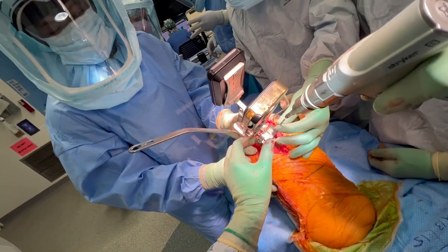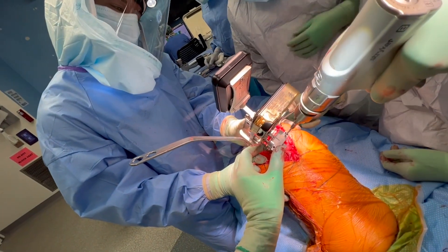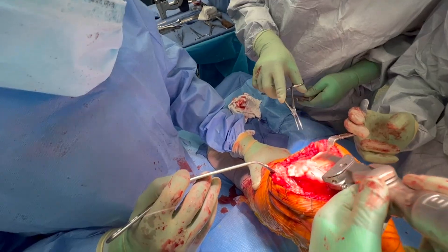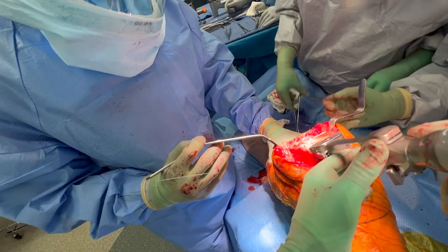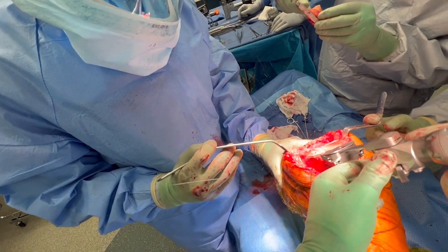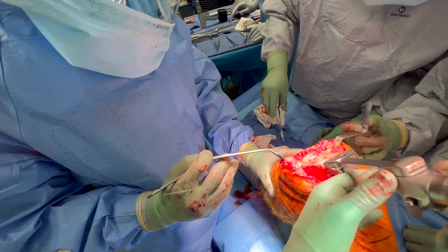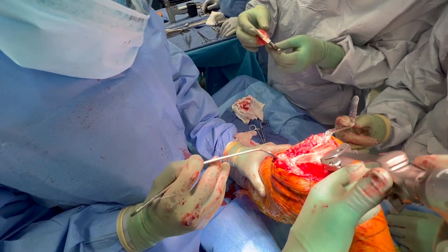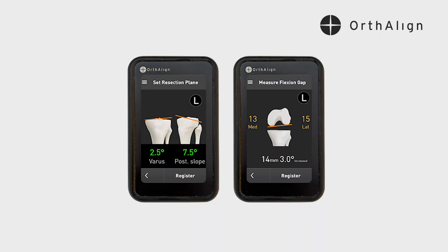I'm going to pin this cutting block in place and make our distal femoral cut. I think it's important to use the caliper here — I like to know exactly where I am. I measure the distal femoral cut and you can see the lateral side cut is a little bit thicker. Measured with inclusion of the saw blade: nine millimeters on the medial side and 11 millimeters on the lateral side. We're right on plan.